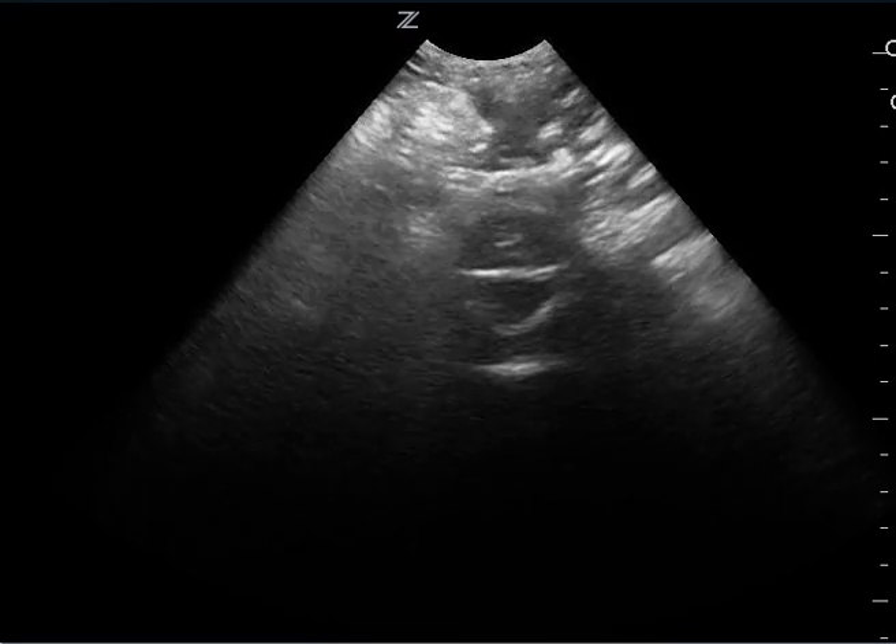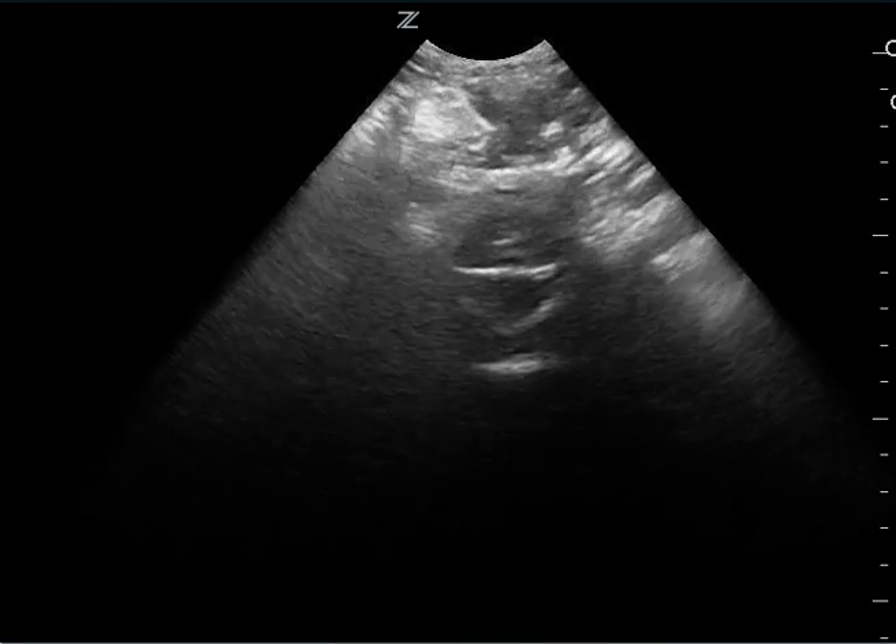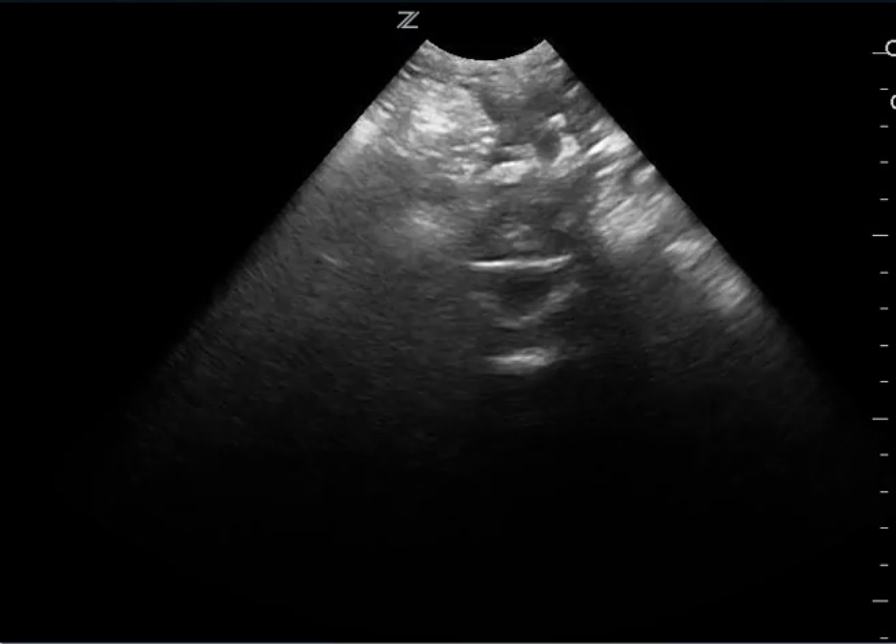In the suprapubic area, you don't see the bladder as well, and so it's hard to make a clinical decision based on the suprapubic space.